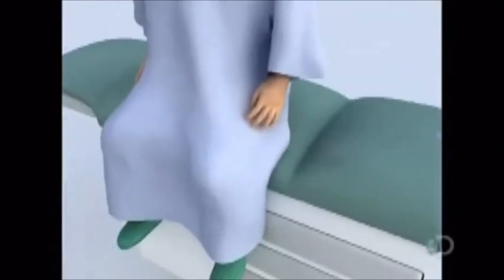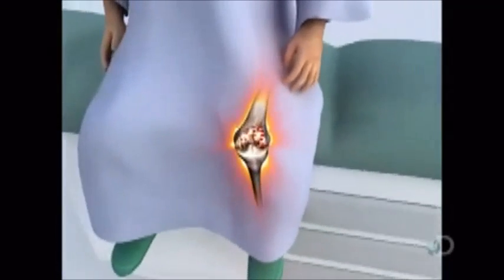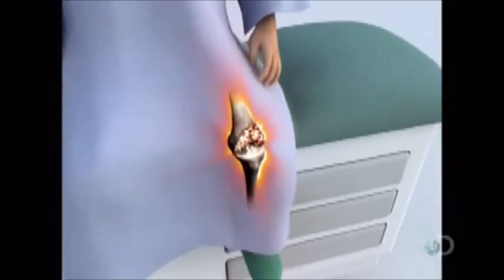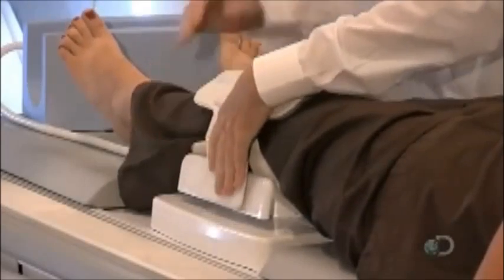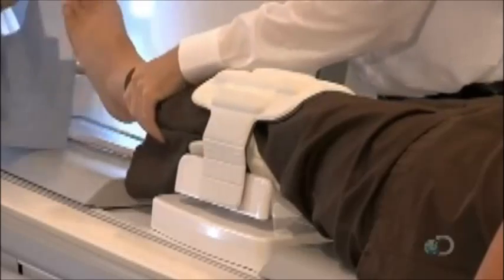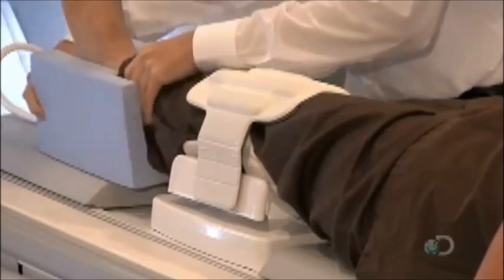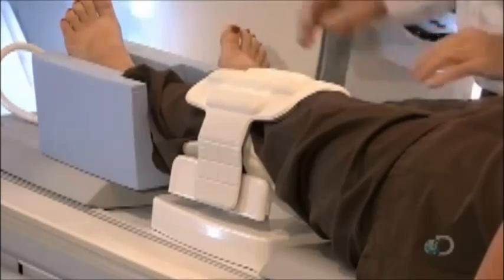A successful knee replacement depends on its alignment with the femur and tibia, the upper and lower leg bones that connect at the knee. That's a challenge, because knee implants are standard, while every patient's bones are unique.